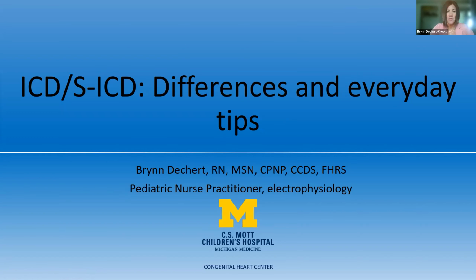All right, so just going through the differences between a traditional ICD, which is a transvenous, or a subcutaneous ICD. I did not today put anything in here about abdominal or epicardial ICDs. We use those pretty rarely, and so I figured that there probably weren't many patients out there with this. Those leads go on the outside of the heart and the generator goes in the belly. But if there's questions about those, I can answer that as well.